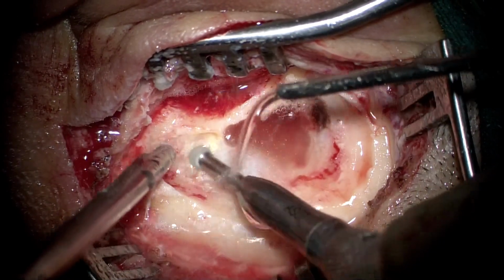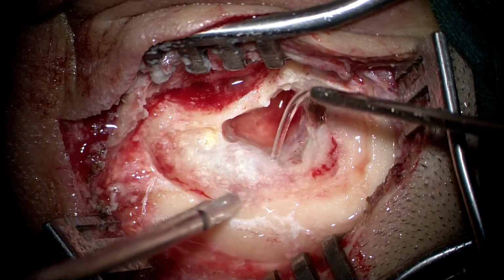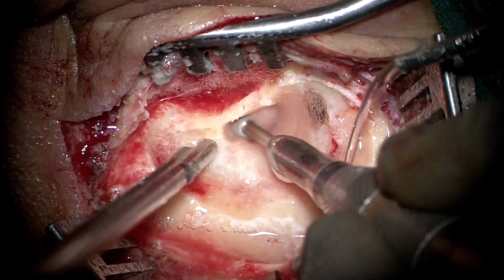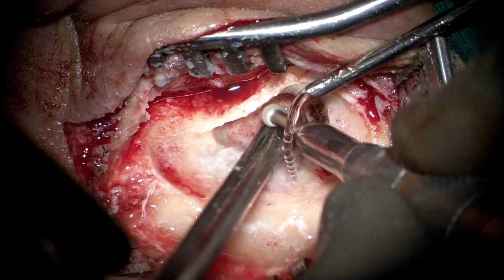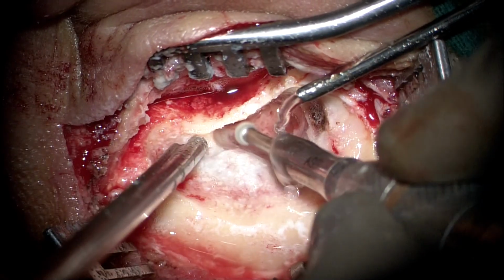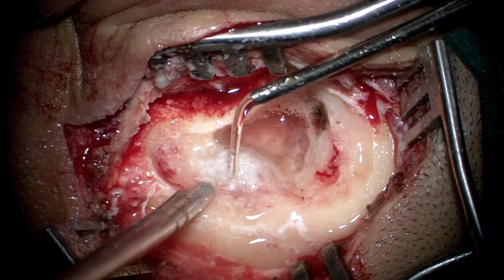Here you are seeing that we are drilling onto the sigmoid sinus plate, all around it. Initially we did it superiorly, now we are gradually, progressively going inferiorly. As we go inferiorly, the burr size must be kept in mind. A very large sized burr will either damage the posterior canal wall, make a rent in it, which we do not desire, or has the potential to just make a hole in the sigmoid sinus, thus causing massive bleeding and frustratingly increasing our surgical time.